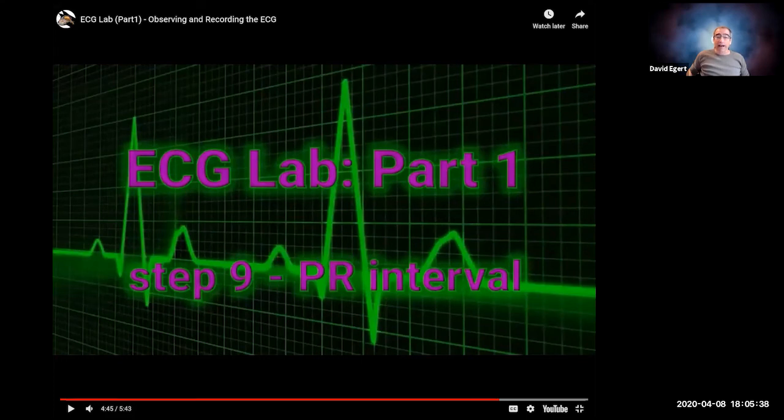So if you want to have a nice signal, that's why we make sure that the subject is relaxed, because skeletal muscle also depolarizes just like cardiac muscle when it's contracting. So if you contract skeletal muscle, it's going to show up as part of the signal as well. And in fact, as we could see, it totally overwhelms. When all of that craziness was happening, the EKG was still happening. It just was totally hidden under all the noise. So does that make sense?